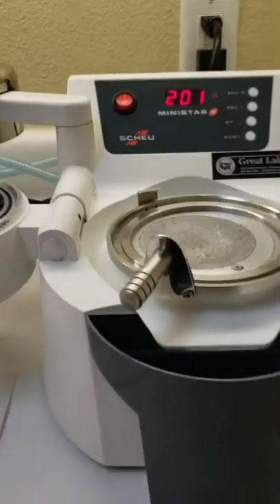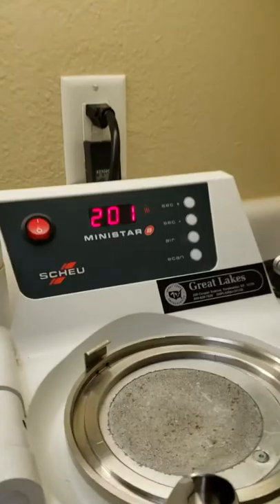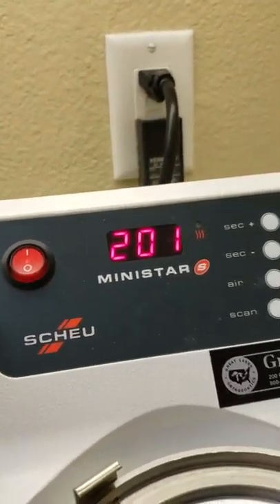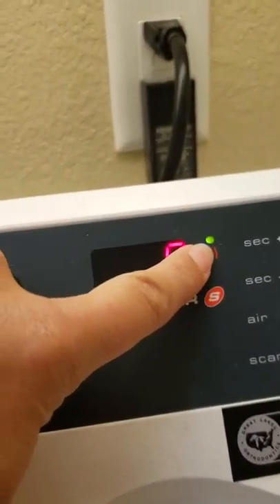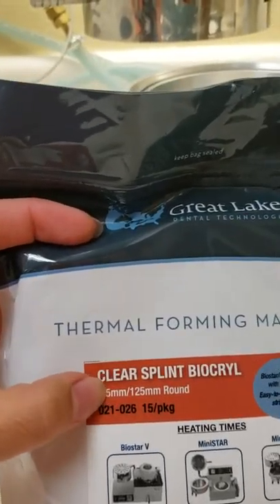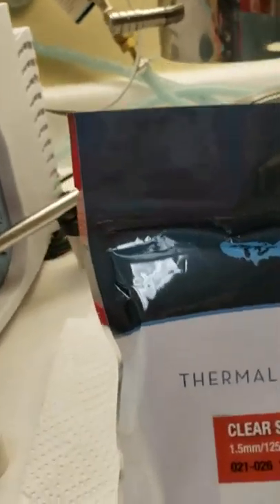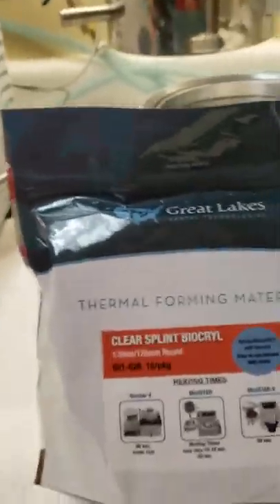This is the power button, so we're just going to turn that switch on and then wait a minute while it warms up — mainly waiting for the screen to go back down to zero and the light to turn green. For Essex retainers, I'm always going to use the 1.5mm material, which is up here in the cabinet.